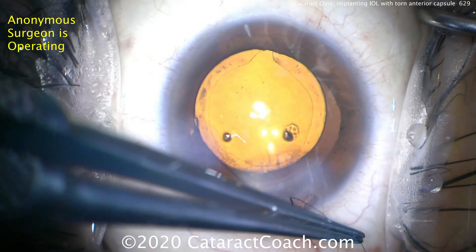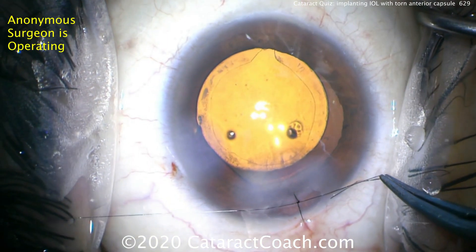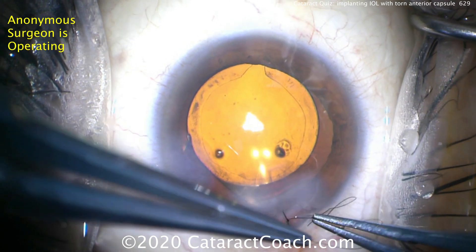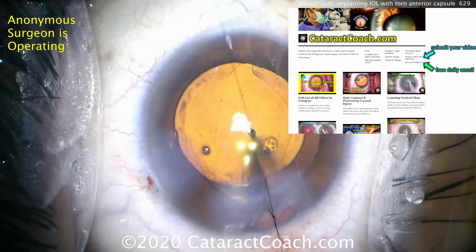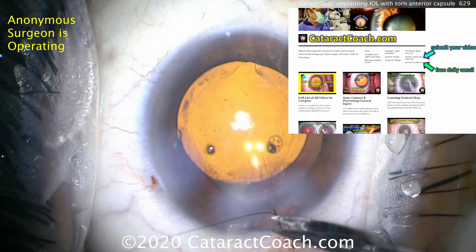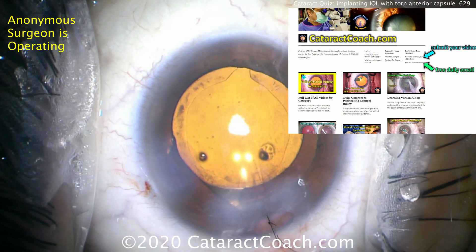What we don't want to happen is for the incision to leak — that may cause shallowing of the anterior chamber, instability, and may cause that capsular rip to go posterior, leading to a dislocated lens. We want to avoid all that. Beautiful case — that's how you manage this. Check out cataractcoach.com, where we have a whole series of cataract quizzes. Click on the link for all videos by category, click on cataract quiz, and you'll learn a lot.